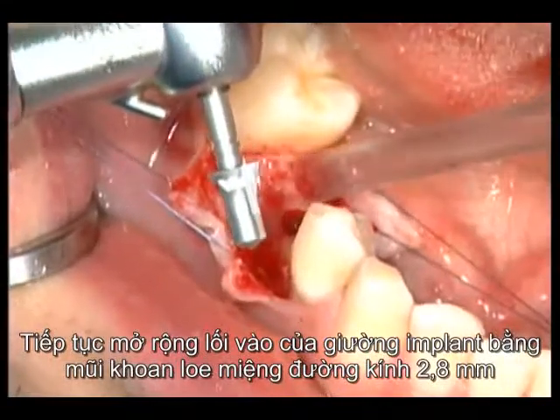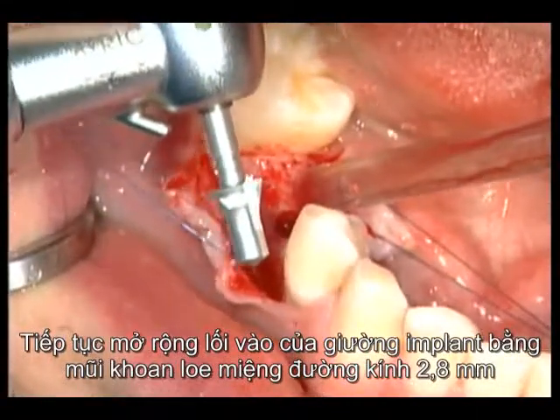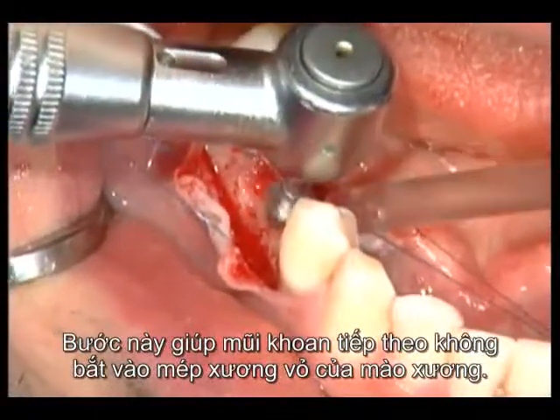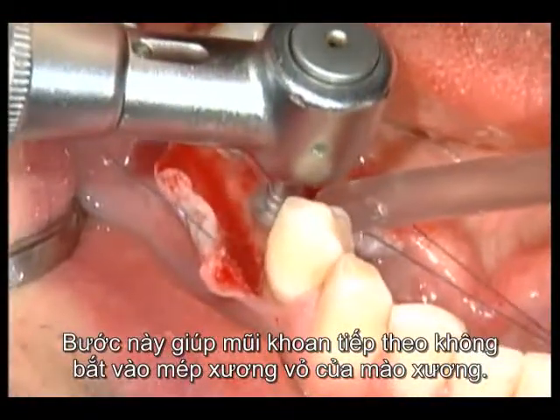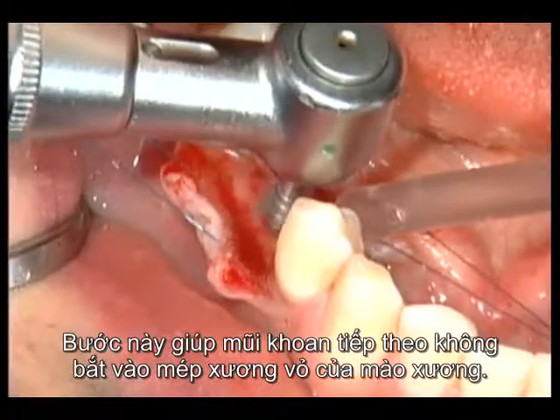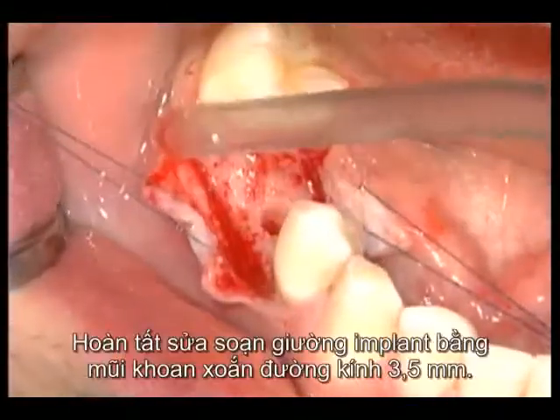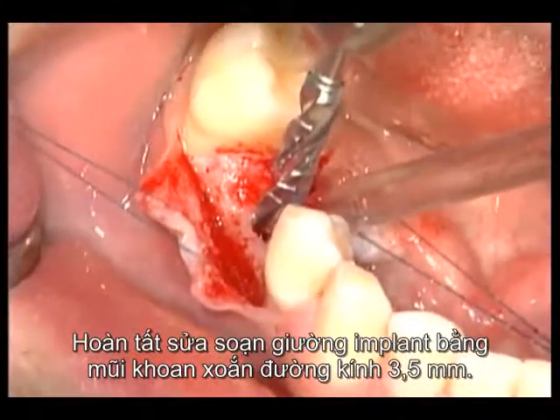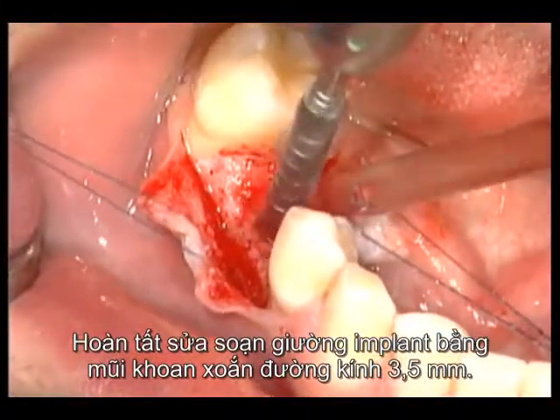The entrance of the implant bed is opened up again with the profile drill of 2.8 millimeter diameter. This procedure prevents the next drill from catching on the edge of the cortical crest. The implant bed preparation is completed with the spiral drill of 3.5 millimeters diameter.